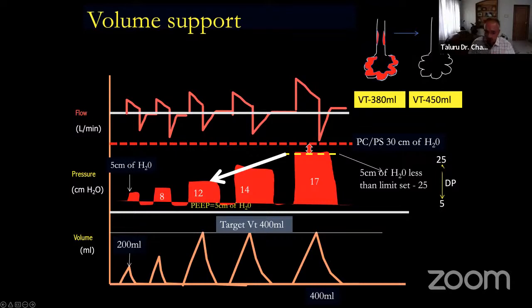So when you talk of a newer mode, don't think it's new, it is pressure support based. You have to see whether it is volume or pressure. Next is which breath type, pressure support or pressure control. Then you have to see what is the target that is being set, what is happening. Then you understand, and then you know how to use it.